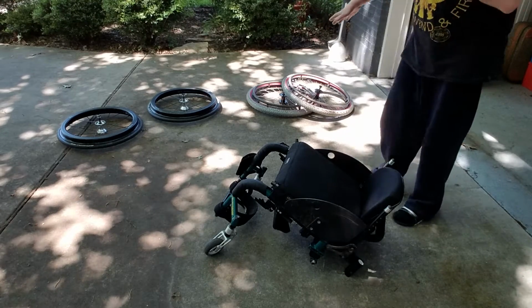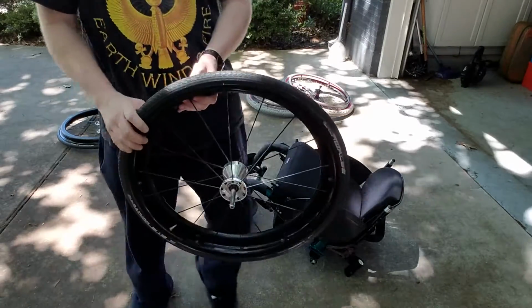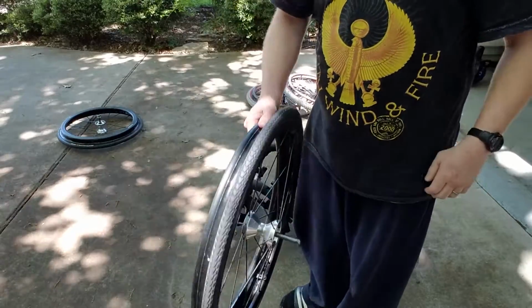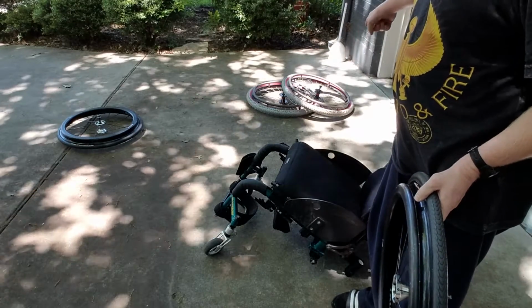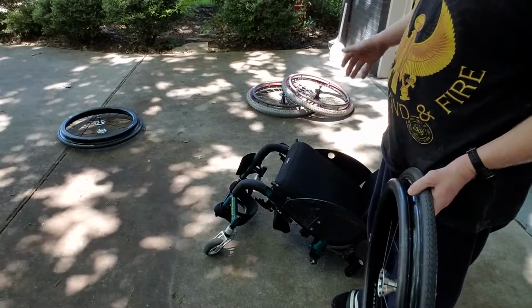Now we have two types of wheels here. This is going to be your standard wheel. It's thin, very lightweight. It's got a nice grip here for when you're wanting to move yourself around. And then in the back we have, I guess these are off-road tires. They're much larger and they've got grip and stuff like that.